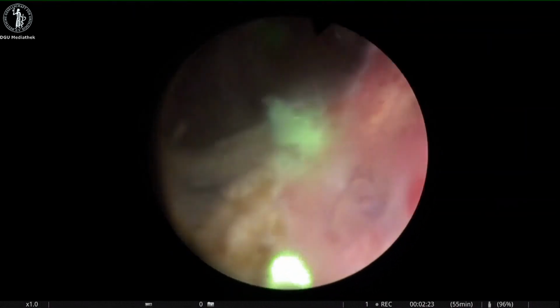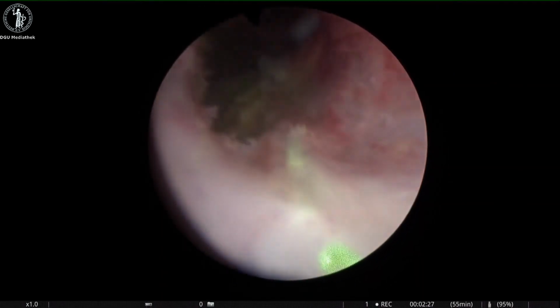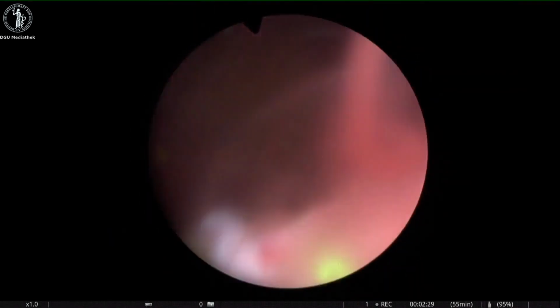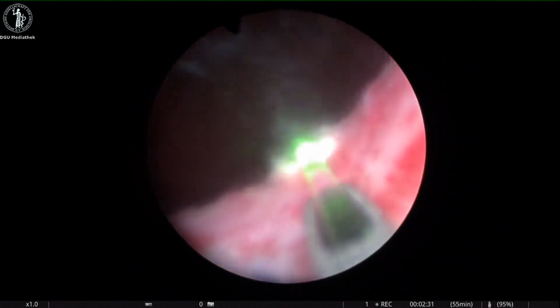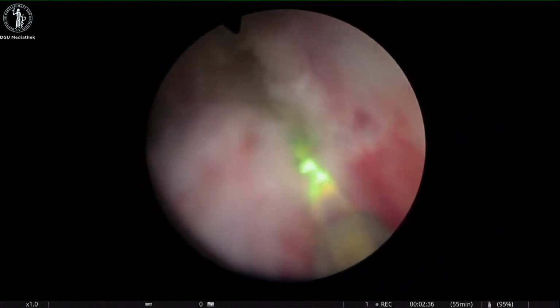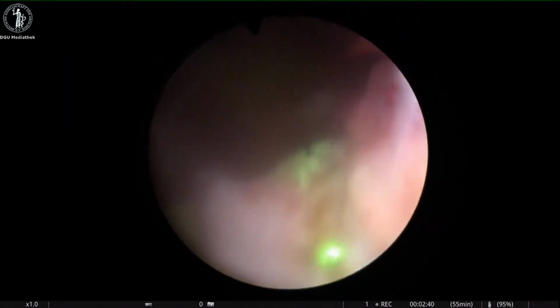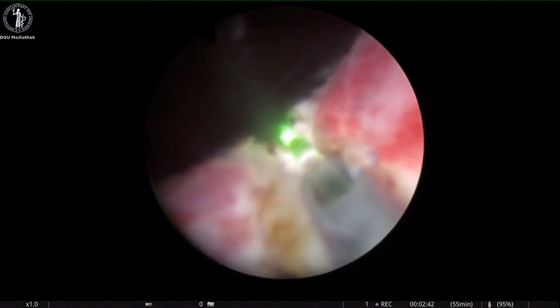The second incision is performed analogous to the first one. Depth of incision is down to the prostate capsule, and length of the incision is from the bladder neck to the paracollicular space.